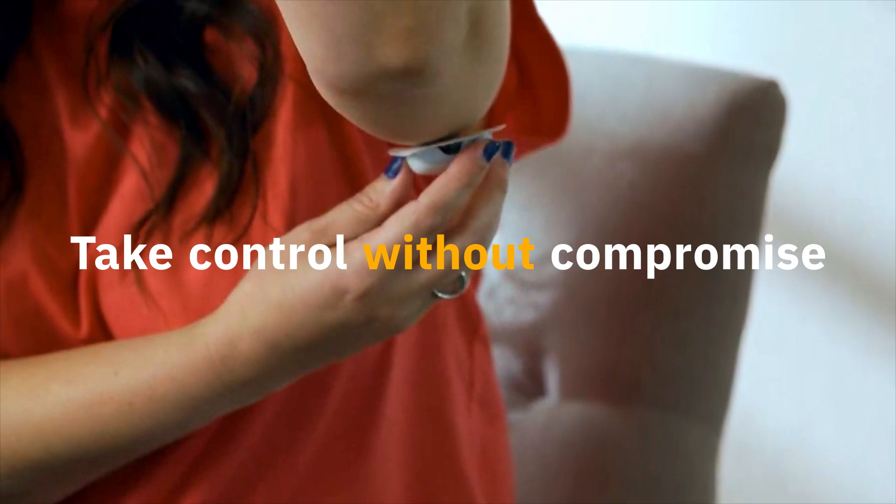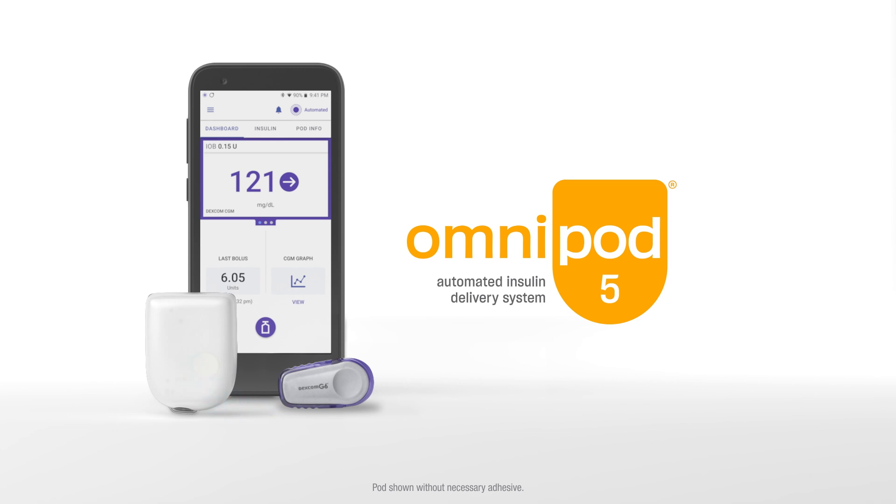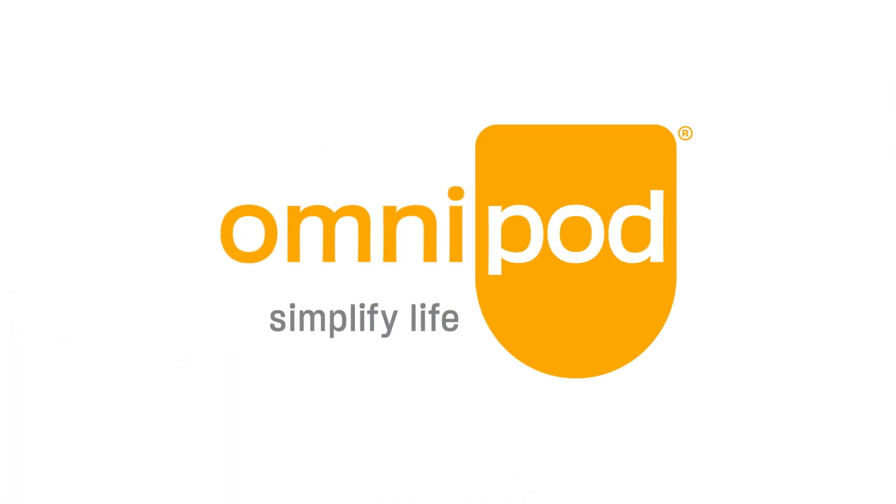Take control without compromise with the only tube-free, waterproof, automated insulin delivery system that integrates with Dexcom G6 or G7. Simplify diabetes. Simplify life. Omnipod 5.